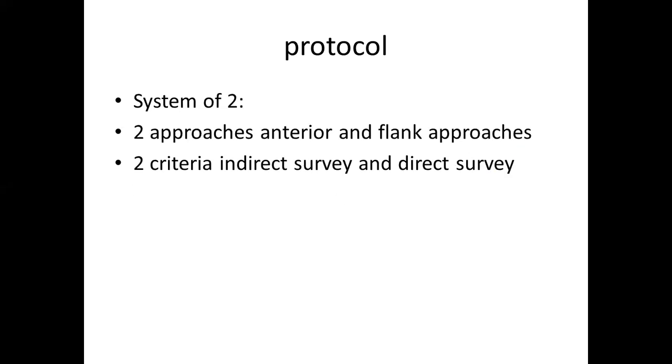So my protocol I just categorized into a system of two, whereby we have two approaches that I was talking about, the anterior and the flank approaches. And we also have two criteria of evaluating the kidneys, which are the direct survey and the indirect survey.